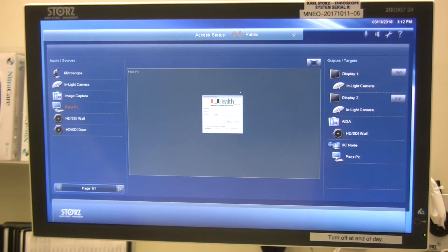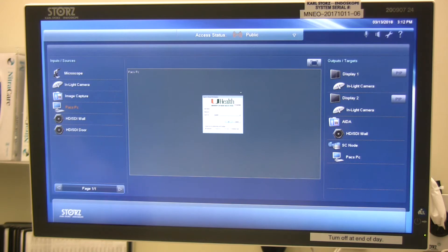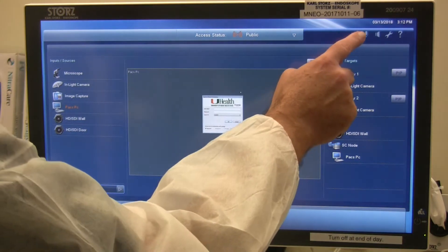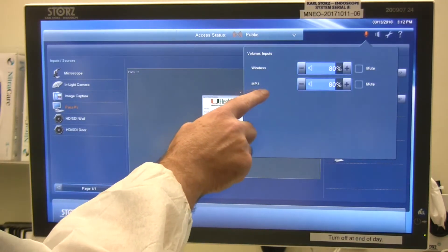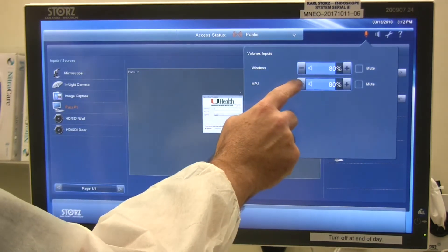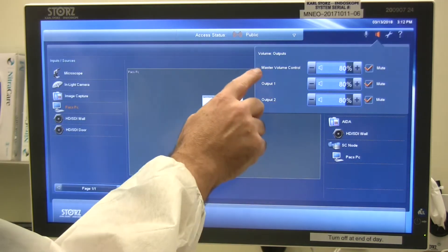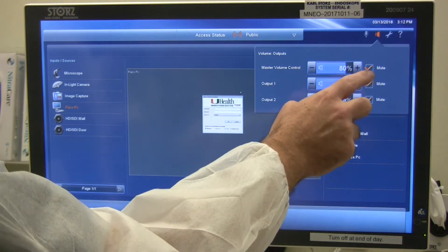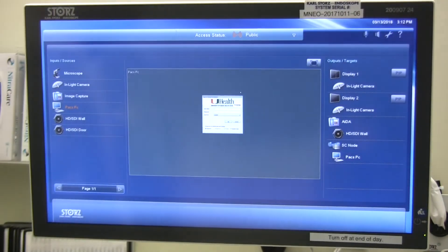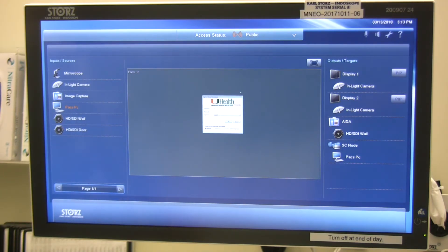Now we're going to talk about managing audio for music in the room. In each operating room, there is an MP3 cable located directly below Display 1, next to the AIDA HD image capture device. You can plug a phone or device into that and listen to audio through the integration system. To manage audio, it's a two-step process: on the top right, there is a microphone showing MP3 — make sure that MP3 is not muted, and adjust the volume control for your MP3. Next to that, there is a button for the speaker — make sure master volume control and output one are off mute. That will allow you to listen to music. For troubleshooting, if you plug your device in and do not hear audio, repeat those steps to get audio running through the ceiling speakers in each operating room.